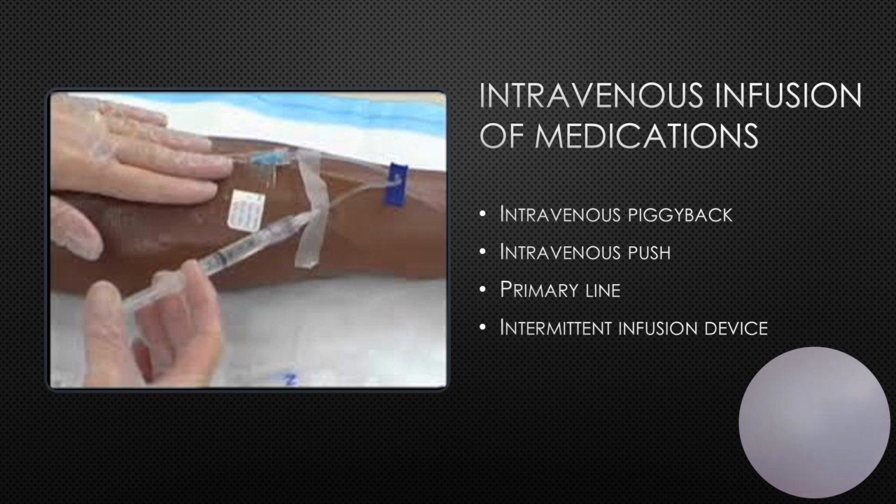Use aseptic technique. Consider that rubber stopper under the vial cap to be unsterile, so always cleanse it. Draw up the required amount of the appropriate diluent. We don't use pre-filled syringes for diluent. Inject into the vial to dissolve. We may gently agitate it by rolling it between our hands. We never shake it. Withdraw the appropriate amount of medication into the syringe and infuse as an IV push medication or inject into a 50 or 100 mL bag of compatible fluid for the piggyback infusion.